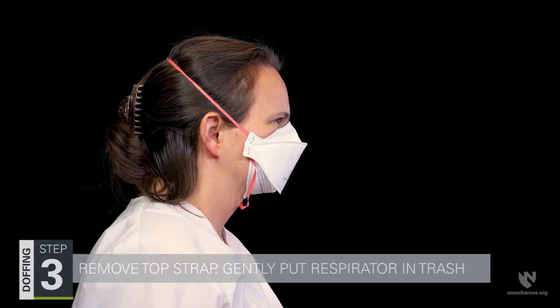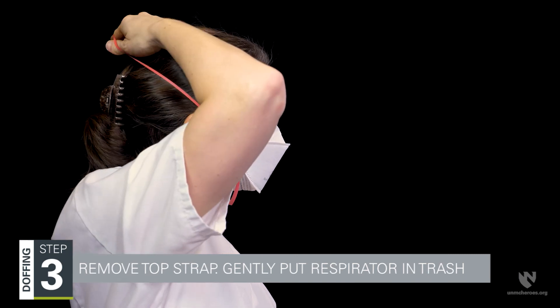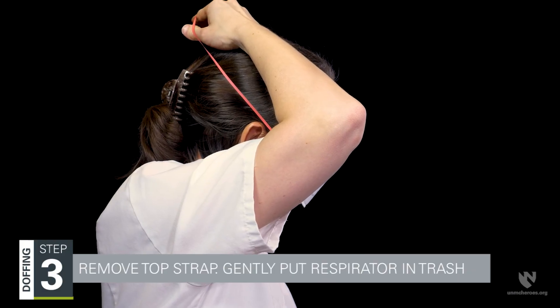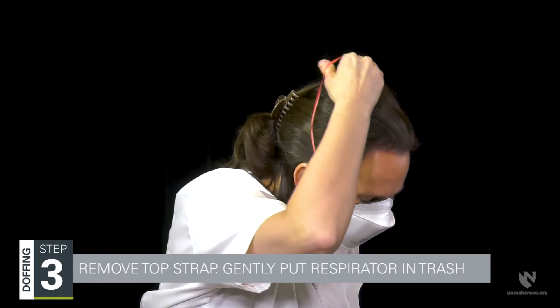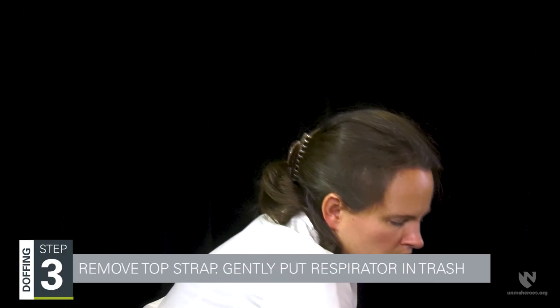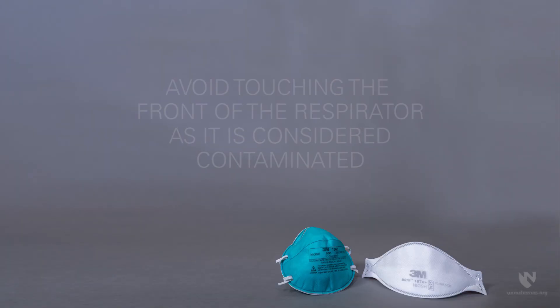Step three is removing the top strap of the respirator. Grasp the top strap at the crown of the head and bring it carefully over your head. Tilt your head forward and gently move the respirator away from your face, then gently place it in a trash receptacle. Avoid touching the front of the respirator as it is considered contaminated.